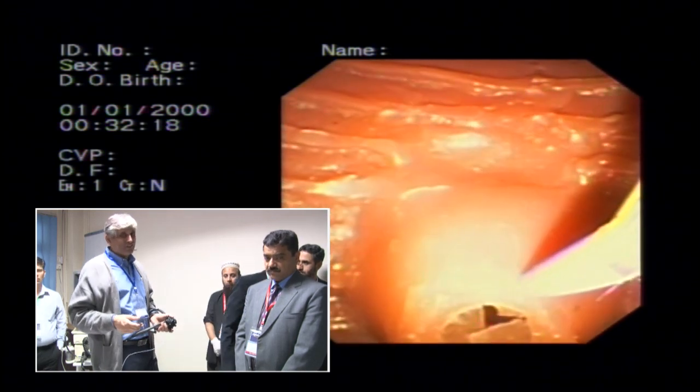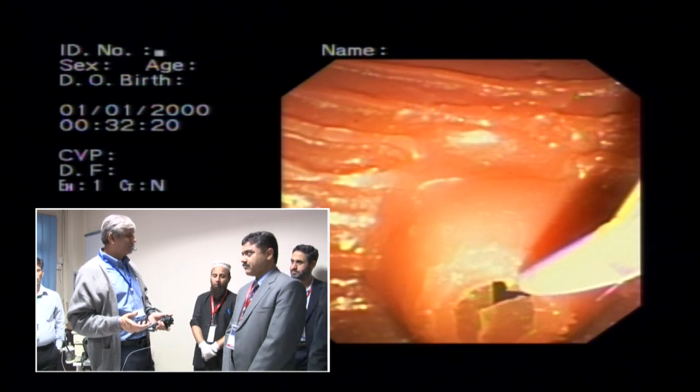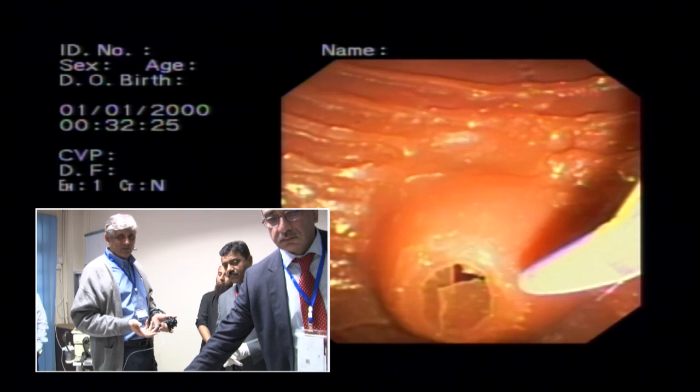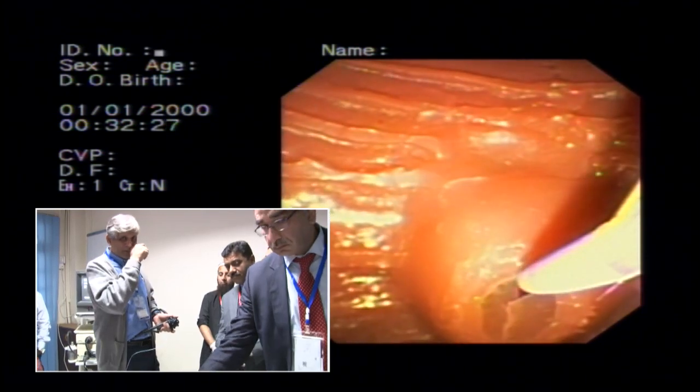You can use different cannulas, but I don't have to do that in my practice, so I really don't. I know Wakar doesn't do it.